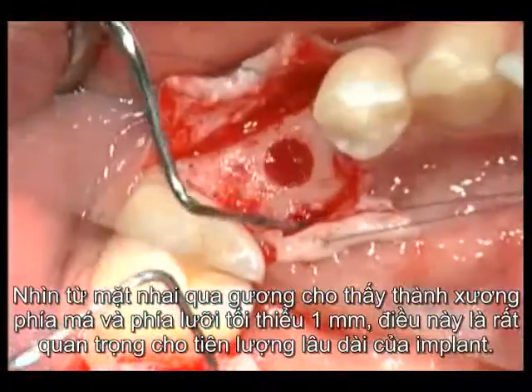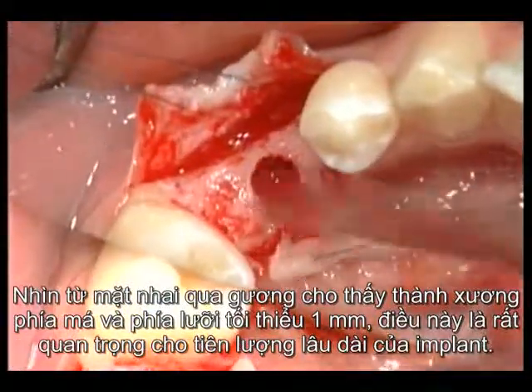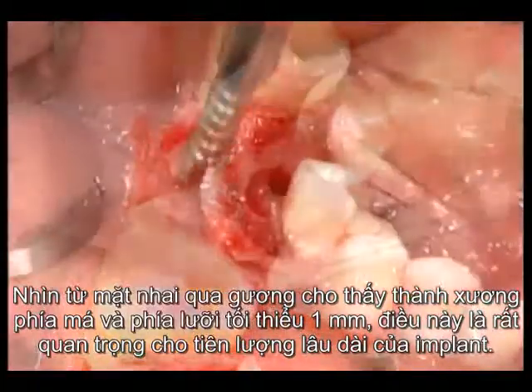The occlusal view in the mirror demonstrates a buccal and lingual bone wall of at least 1 millimeter, which is important for a good long-term prognosis of an implant.